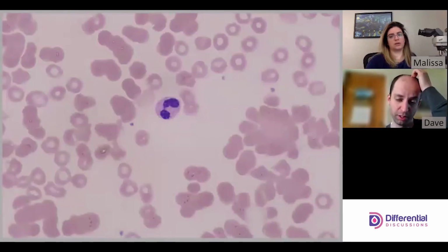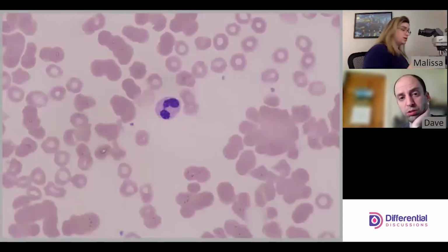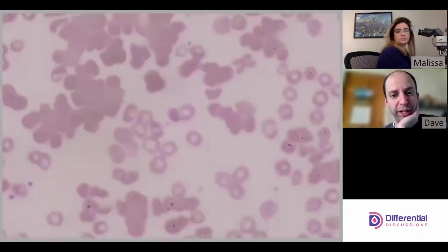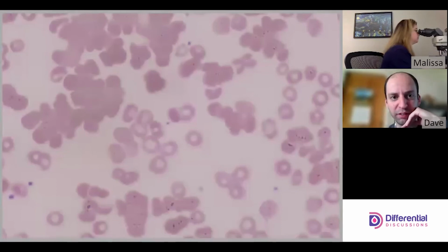Let me just move to another field so that we can get some other looks at what agglutination looks like. While you look around, I'll just do what I do best and blow hot air at everybody. So we're looking around, we're looking at these clumps of cells. We're seeing what we can see, but like I said, a lot of that might be hidden by the agglutination.